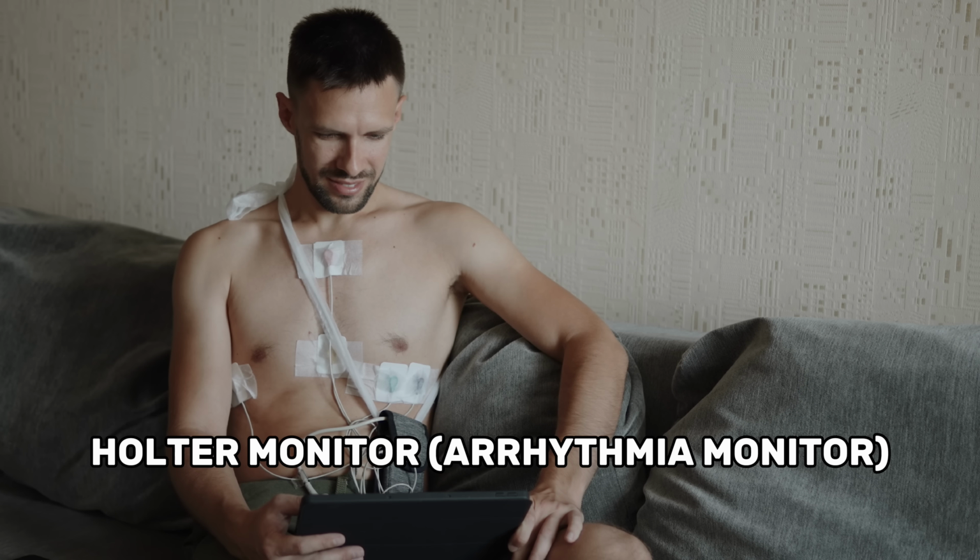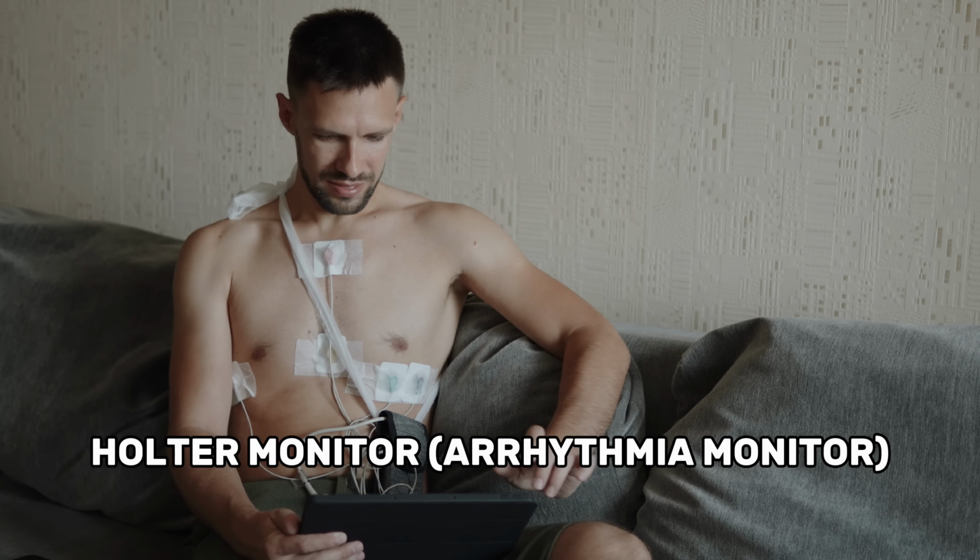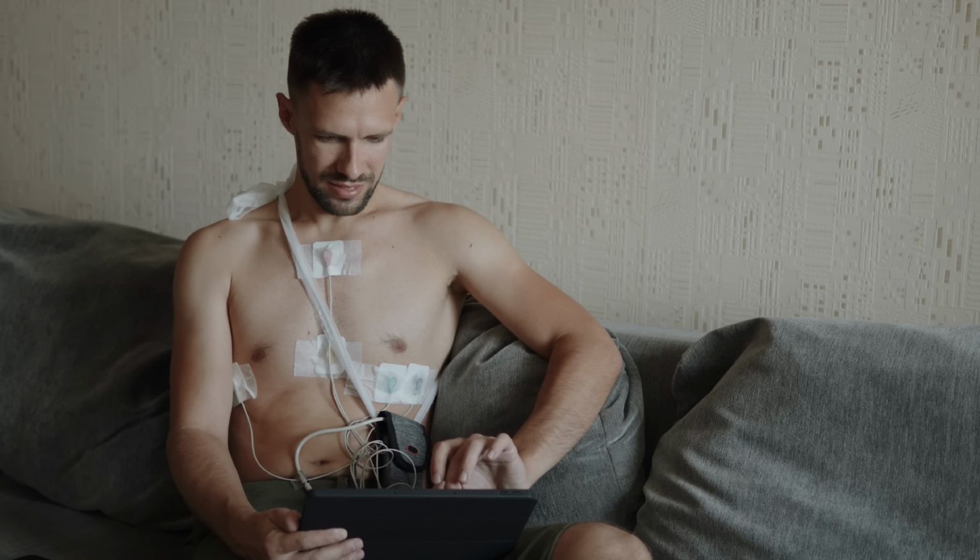Now, in terms of arrhythmias and things like that, what tests are we talking about? Right. So that's a test called a Holter monitor, or an arrhythmia monitor. Holter monitors have really changed a lot, or they're starting to change. The typical Holter, I think most people would be familiar with, is we put a series of leads on your chest. The leads are connected to a box that you often just wear on your hip, and that will record all your heartbeats over the course of however long we book this for. We have 24, 48, and 72-hour Holters.